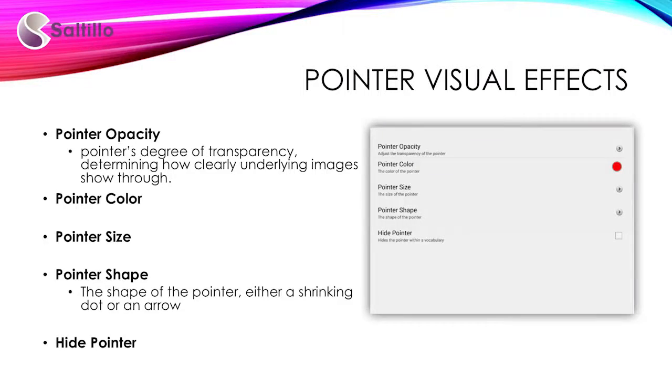Pointer color. It's recommended that you use a bright color such as red or bright blue. If you have dark buttons set up in your vocabulary, you would want to use a white or bright yellow pointer.